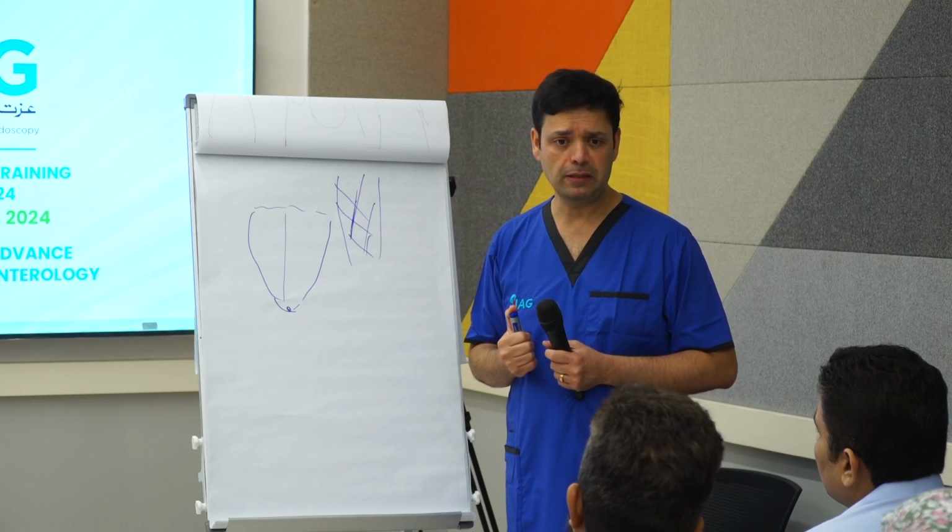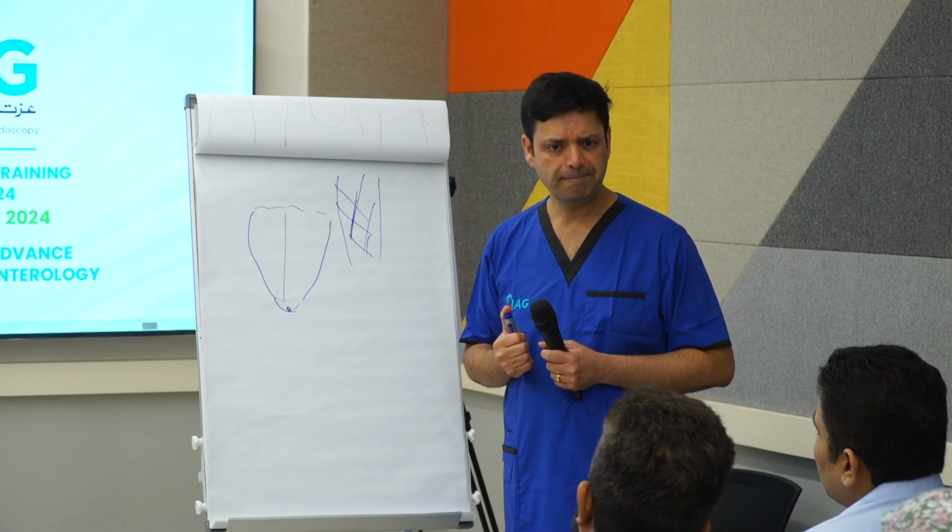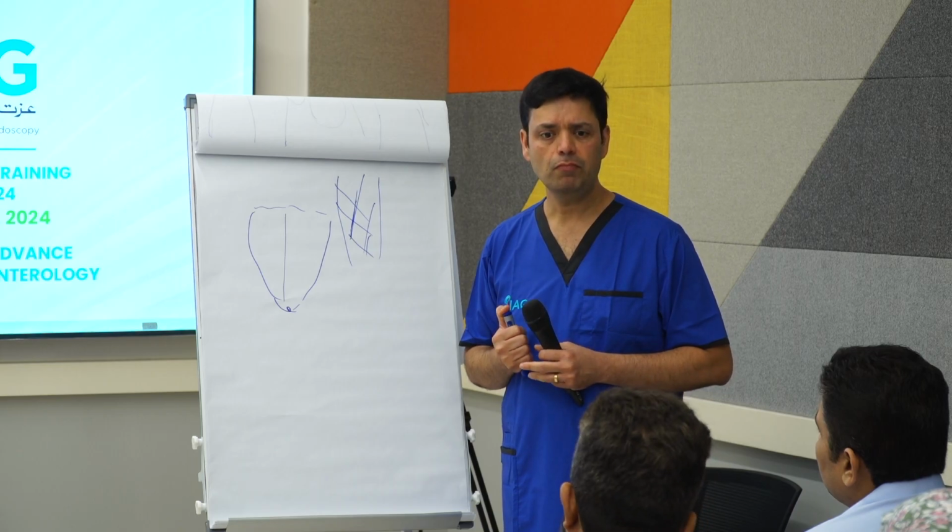You mean sphincteroplasty? No, that. I want to ask if you find a distal benign stricture. Okay.